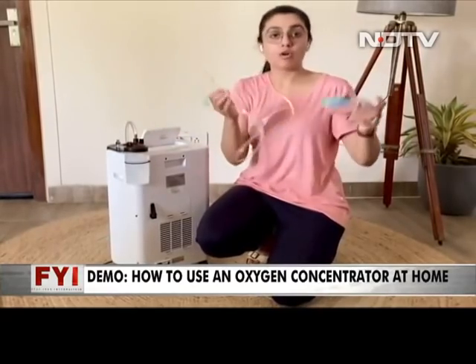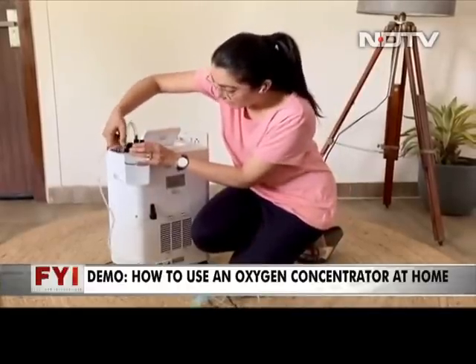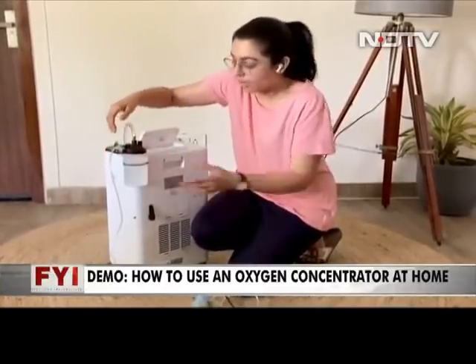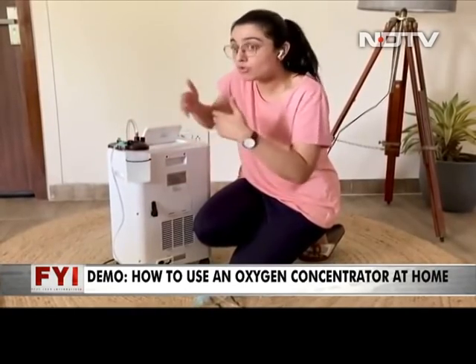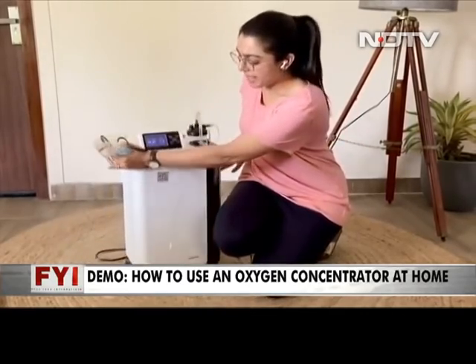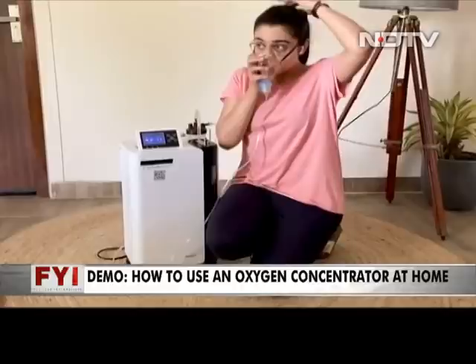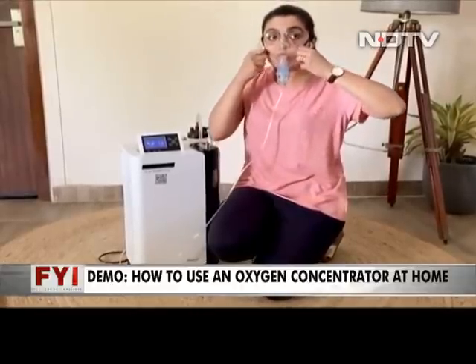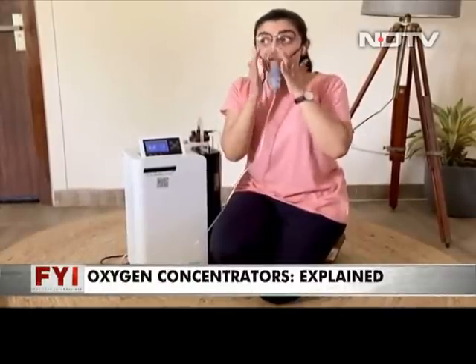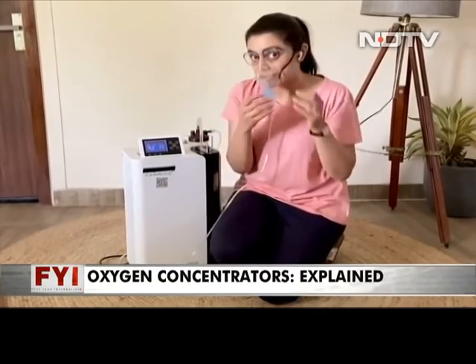Then comes in place the all important cannula. You've got to attach it to the bottle outlet over here and attach it nicely. Otherwise the flow will not happen. Also the cap has to be jam-packed so that there's no air flowing out of it. Now what I have over here is a mask. A lot of times these oxygen concentrators come with a nasal cannula which can be used as well. Put this in, fit it properly. That's absolutely crucial because you should be breathing in air only coming out of the concentrator, so there should be no outside interference of it.